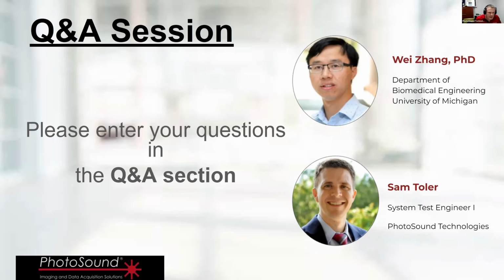Okay, so I have another question from Paul Carson. Thanks for participating, and I can answer that myself. The question was, did I understand that one of PhotoSound's devices allows pulse echo as well as high gain preamps on the same transducer element? That is correct. That's our Moleculus system.